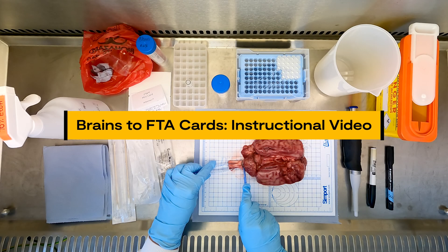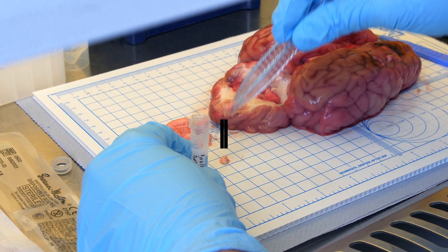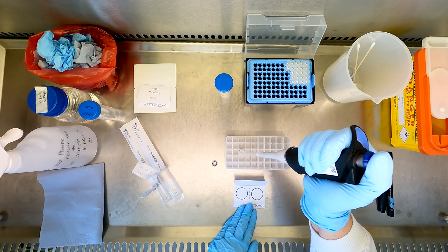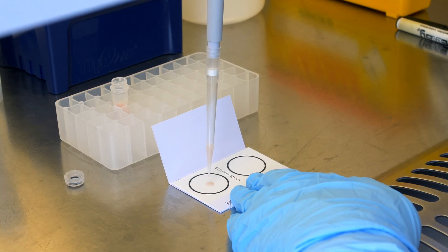In this instructional video, trained personnel will demonstrate how to prepare and apply a livestock brain onto Whatman FTA cards in a laboratory setting. This procedure can be adapted as required for use on a variety of wild or domestic animal species which have suspected rabies infections.